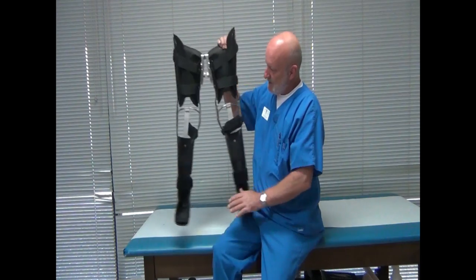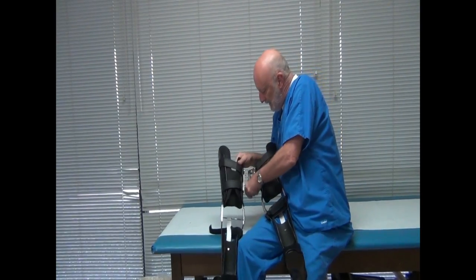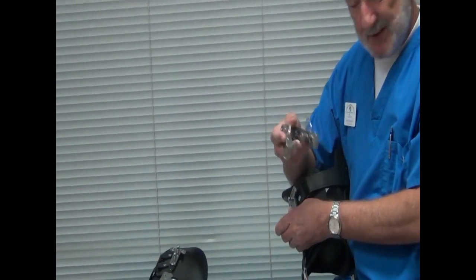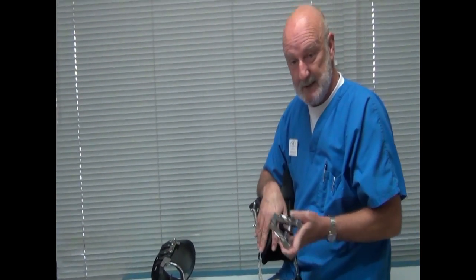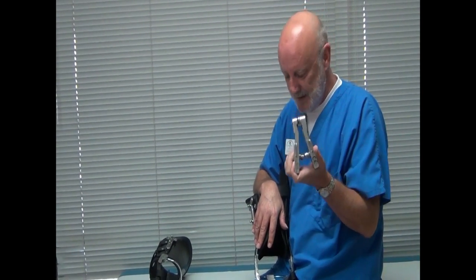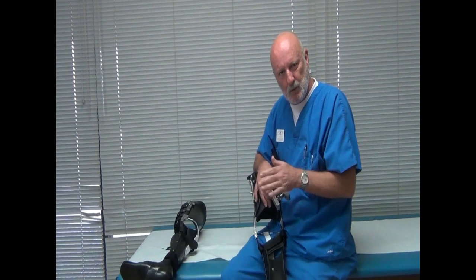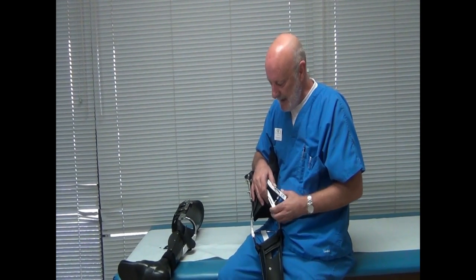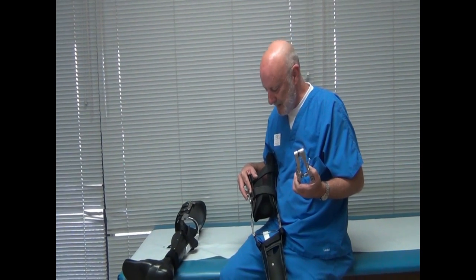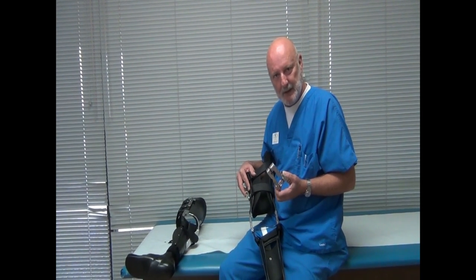Basically how this works is the device clips on through a mounting plate here, and this is the Up and About system available through Cascade Orthopedic Supply. It was designed in New Zealand — just a very heavy duty stainless steel component. We've already pre-fit these KFOs to this patient, a young woman who was paralyzed in a motor vehicle accident, and she's getting married and would like to walk down the aisle.